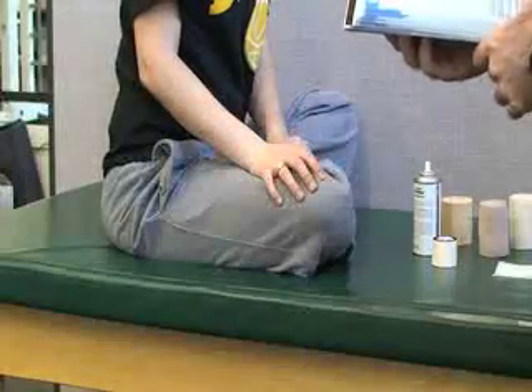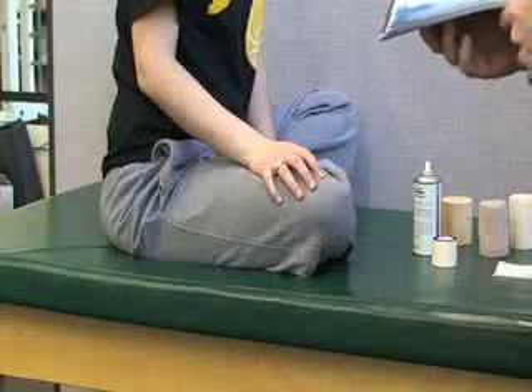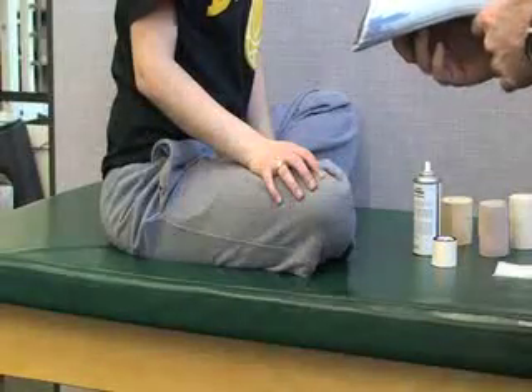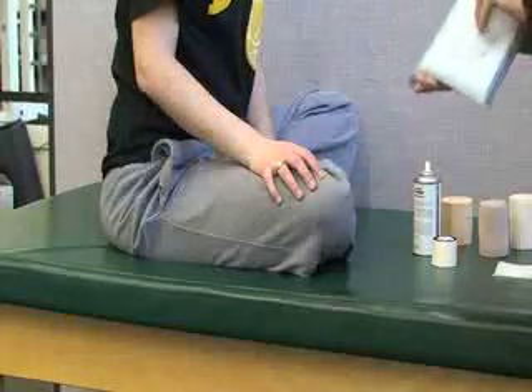The next taping is an X taping for the wrist. This technique provides moderate support and limits excessive flexion or extension when preventing and treating sprains, TFCC injury, fractures, and dislocation.